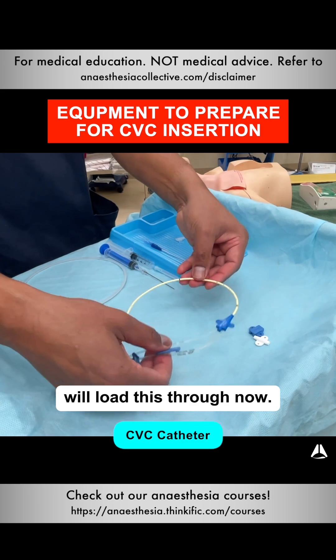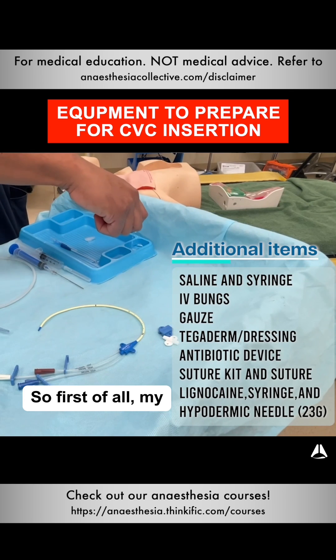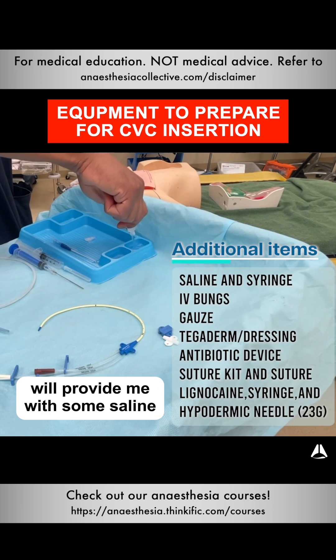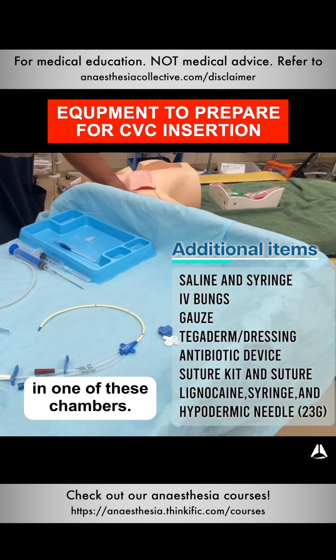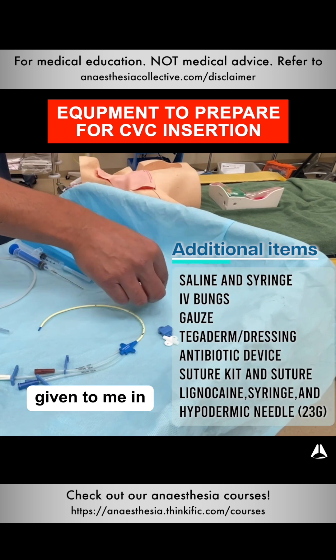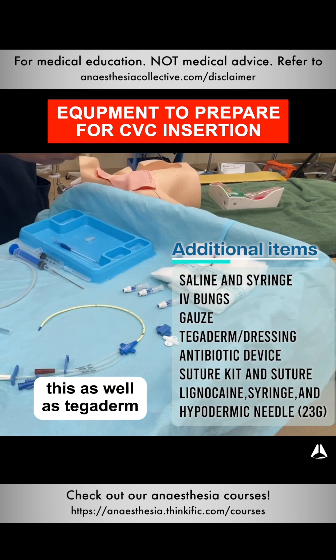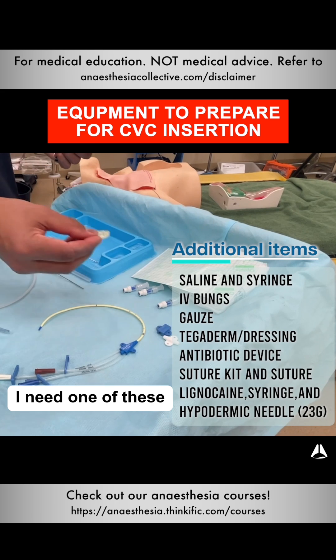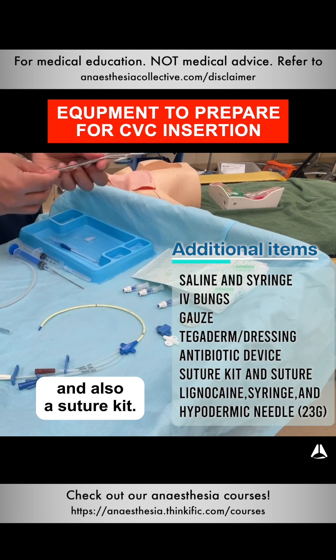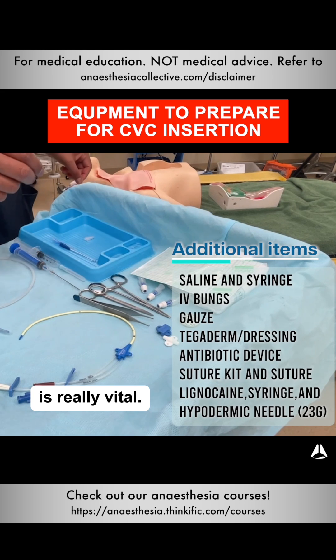The final thing I do is load this through. Now there are some parts of this kit that aren't adequate. My assistant or nurse will provide me with some saline in one of these chambers. I will also need IV bungs in some kits, so I get those given to me in a sterile fashion. I need plenty of gauze for this as well as a Tegaderm dressing afterwards. I need one of these antibiotic coated discs and also a suture kit. Having enough trolley space is really vital.